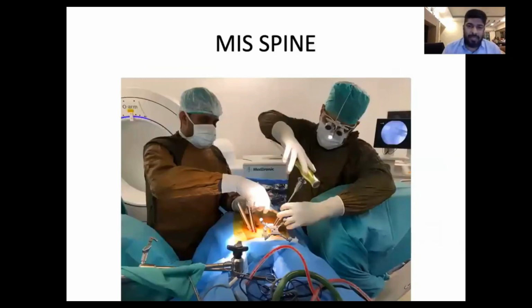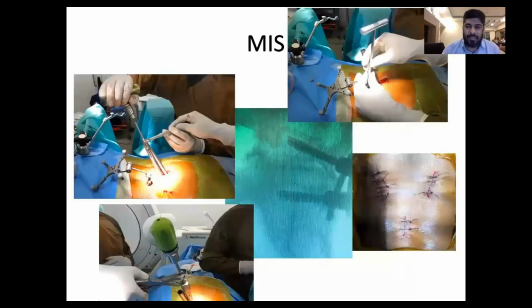Big advantage in minimally invasive spine, you have to just do it like a standard spine, but you really have a big advantage of O-arm navigation, as you are seeing a GPS-like technology on the navigation, and you're doing it. It's a big advantage. That's what I will definitely say.